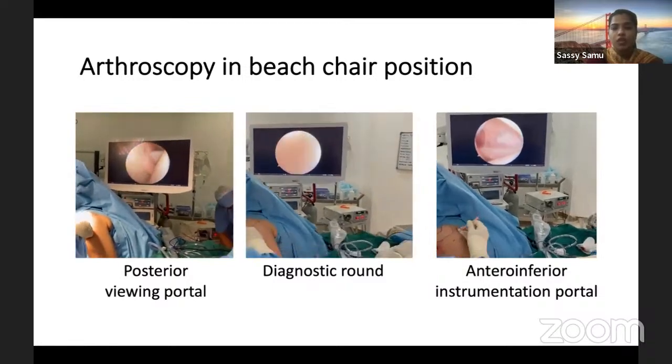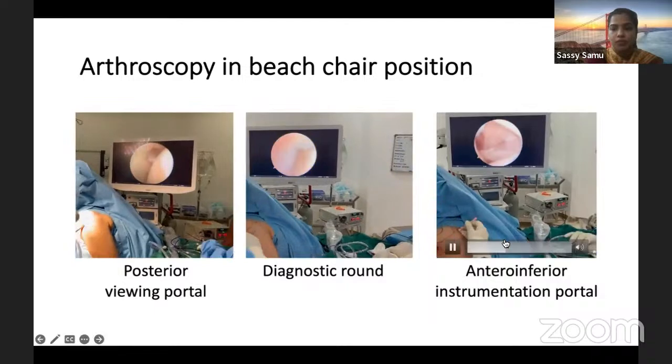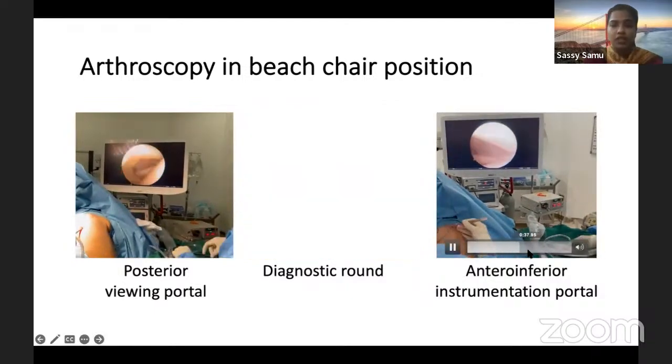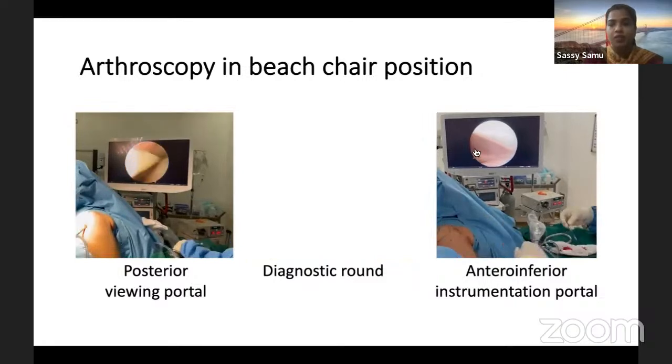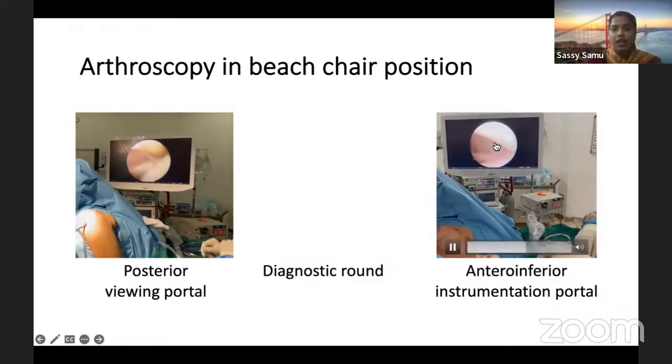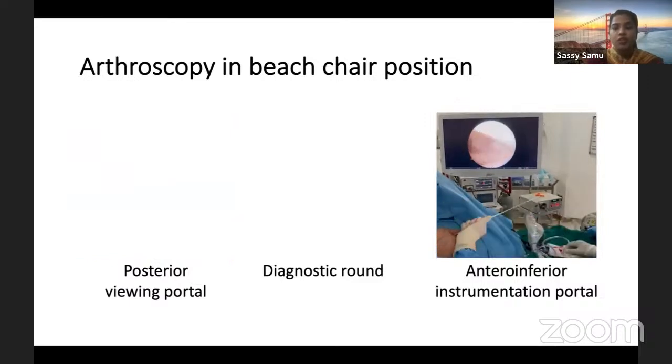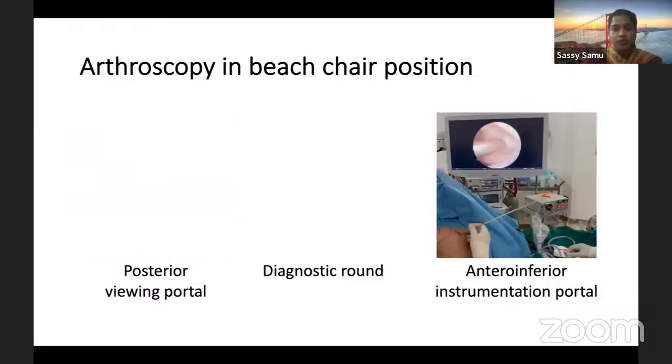And then you can start using a probe and then start visualizing the structures, palpate the biceps tendon, look for any laxity in the biceps tendon, palpate the glenoid, and then the rotator cuff structures.